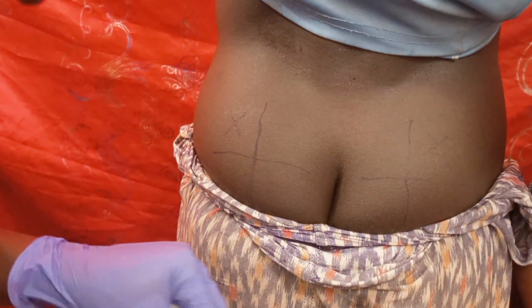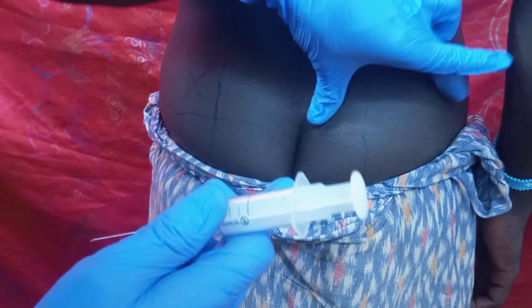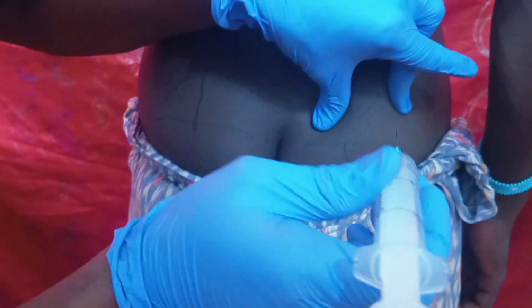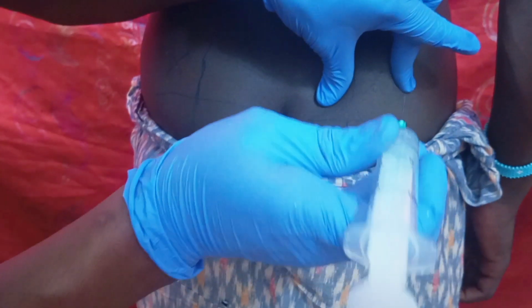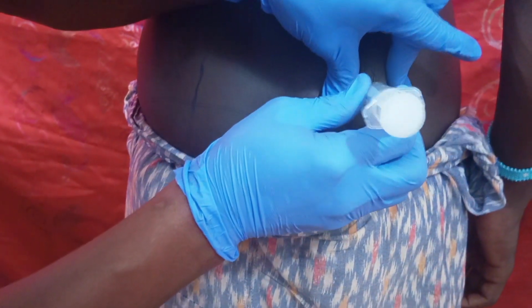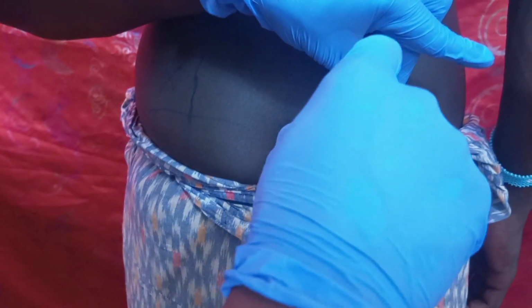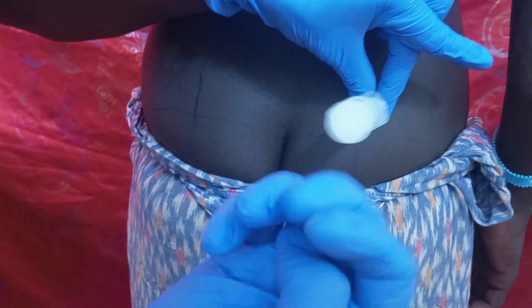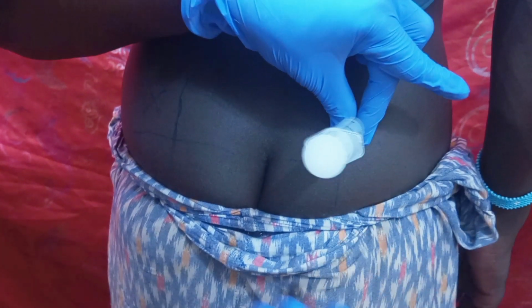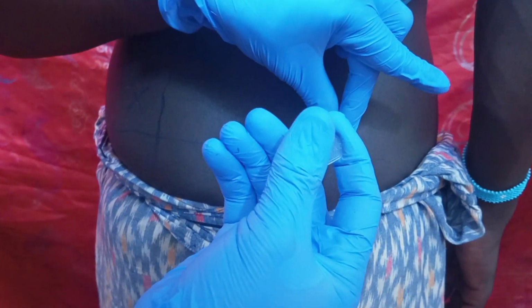So now let us do the procedure. Let me give the injection in the right side of the gluteal muscle. I grab the skin like this, then I insert the needle 90-degree angle deep into the muscle. When you insert like that, you hold the cap of the needle, then you aspirate first. You pull back the plunger to check if there's blood entry. I hope you can see I have aspirated, so there's no blood entry. So I give the injection safely like this.